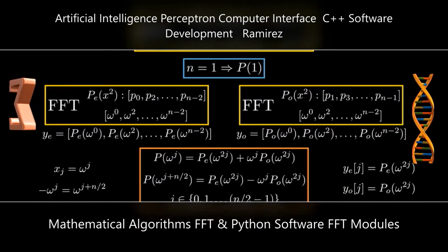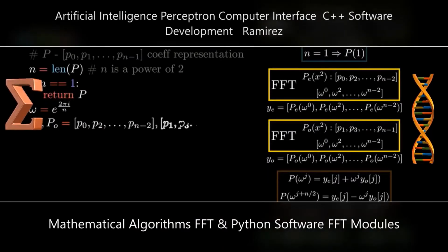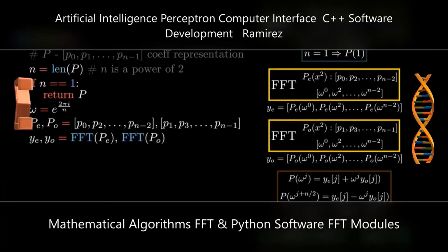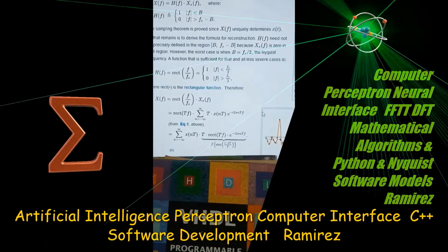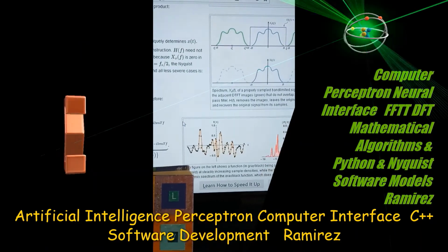The frequency resolution of the FFT was fixed as 0.2930 Hz, and the frequency components between 3 Hz and 35 Hz were selected.